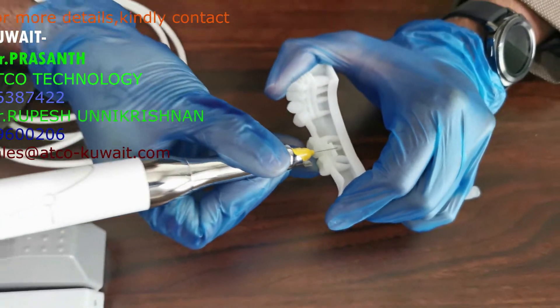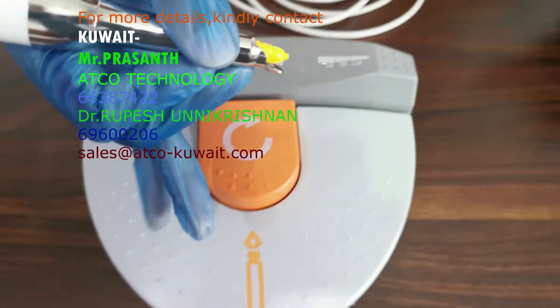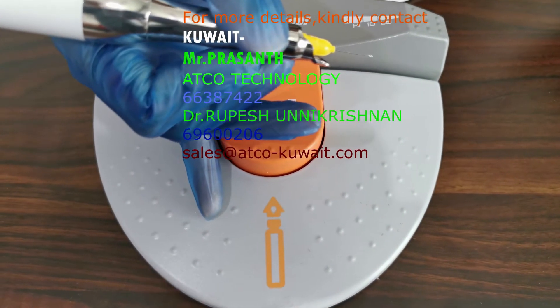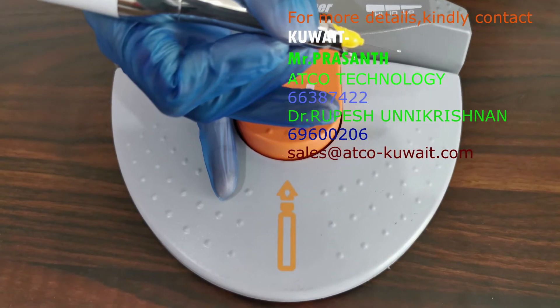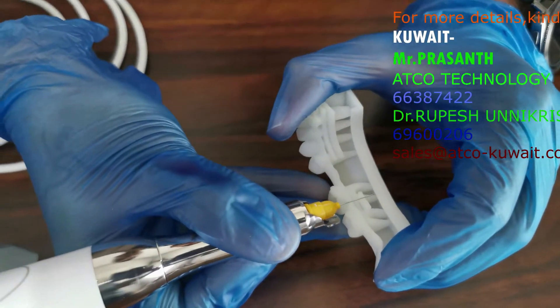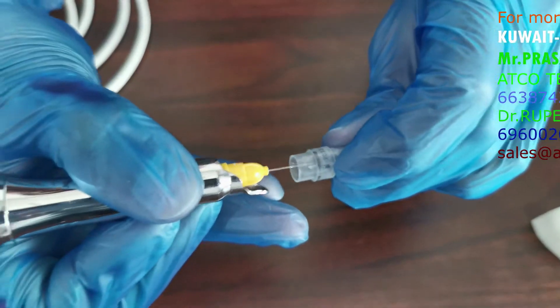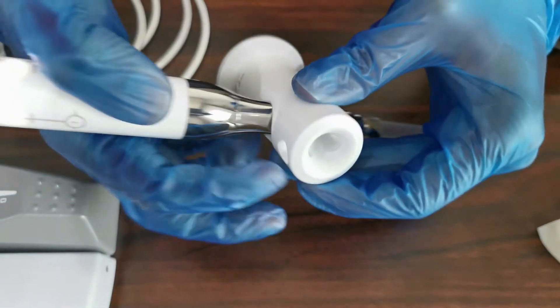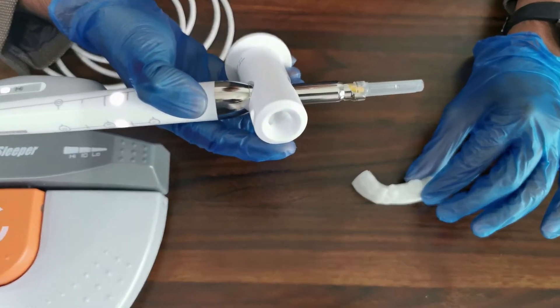So what's next? Step three is to deliver the anesthesia within this particular space or chamber, and for that we go back to this foot pedal. This foot pedal now delivers the anesthesia to your requirement. With this device you can anesthetize anywhere from one to six or eight teeth with one carpule, depending on your requirement and the case itself. Once I have delivered the anesthesia I simply take out the device, close it — and this is where the needle holder comes in place. As this is going to be attached to the chair, I just place it and that's it. This will take hardly a few seconds, and now you can immediately start working on the patient.